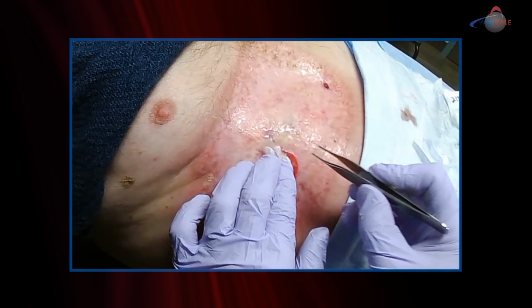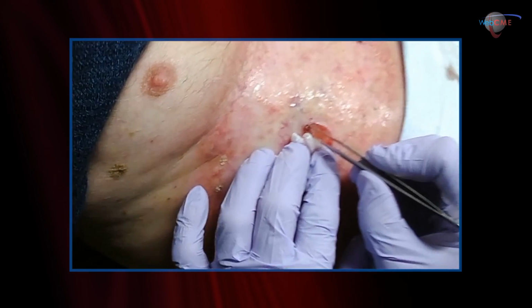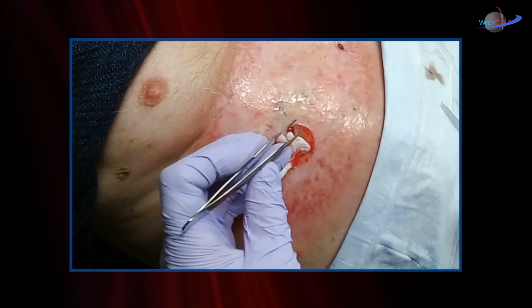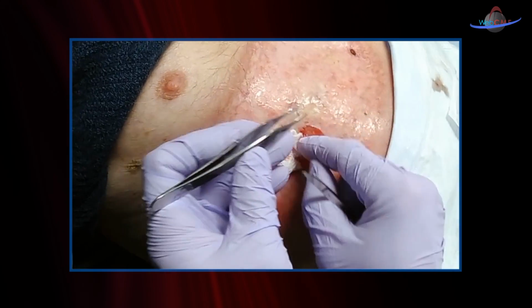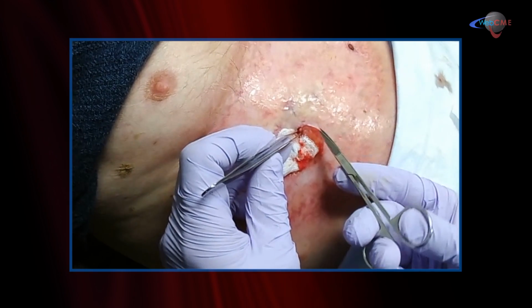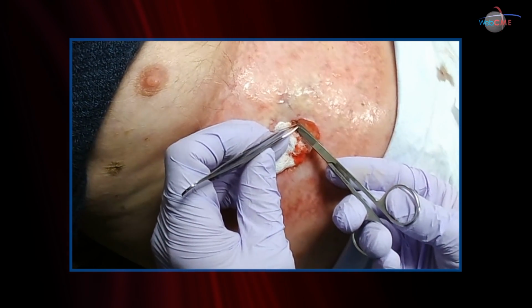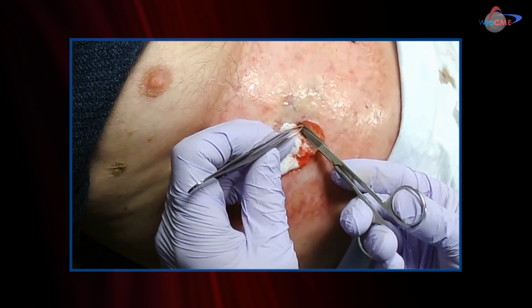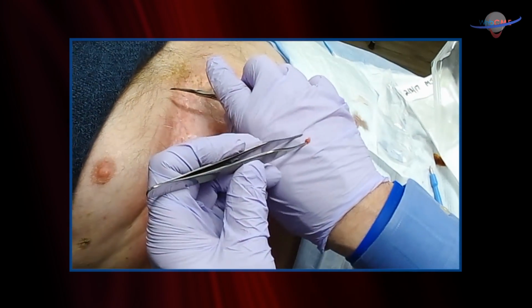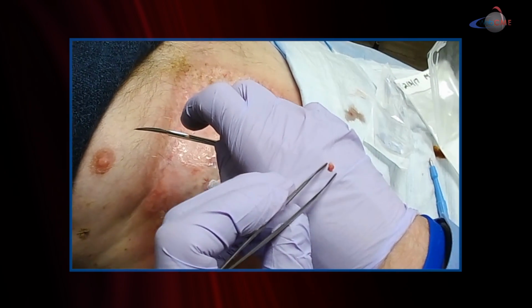And what I want to do now is pick that core up very gently and atraumatically. See how it pops out of the wound. I'm trying to be atraumatic, not to squeeze or damage the tissue. I'm going to pick it up, come underneath and snip that core out. So we're getting a full thickness biopsy, as you see right here. You can see there's the core, there's the surface.